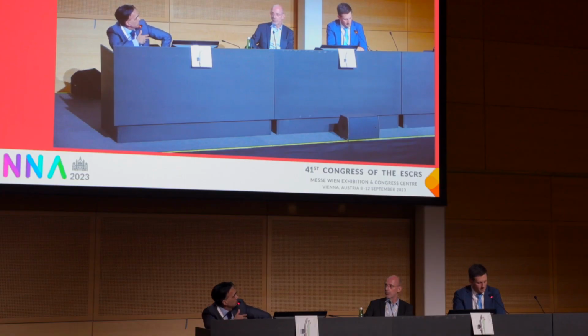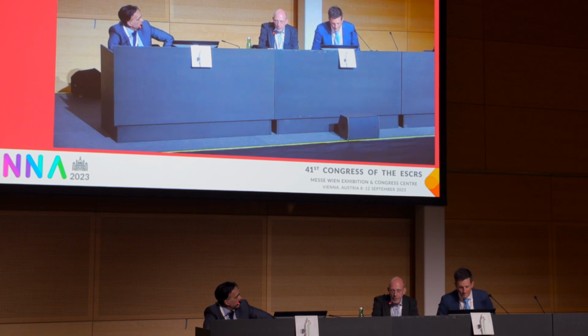Okay. Do you have the same experience, Noël, in the Netherlands as well with the nighttime driving? Yes, I think you need to be careful when you counsel your patients. That should be one of your questions as well. If you do a lot of nighttime driving, then obviously you choose the lens that best fits the daily life of the patient. We have talked about it in the past. Of course, if you implant certain lenses, then you can have problems with nighttime driving. Yeah, and I think these lenses are more forgiving. Yeah. Okay.